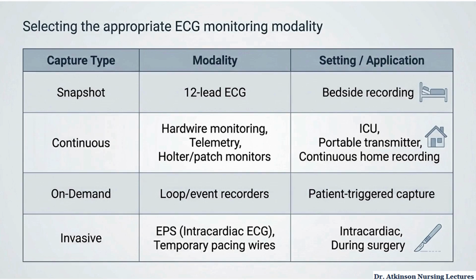Match the monitoring type to the setting: 12 lead for bedside recording, hardwire or telemetry in the ICU, Holter or patch monitors for continuous home recording, loop recorders for patient-triggered capture, EPS for intracardiac studies, and temporary pacing wires during surgery.